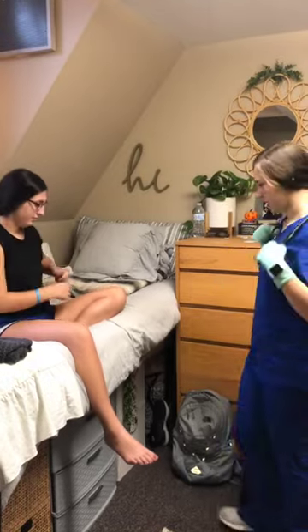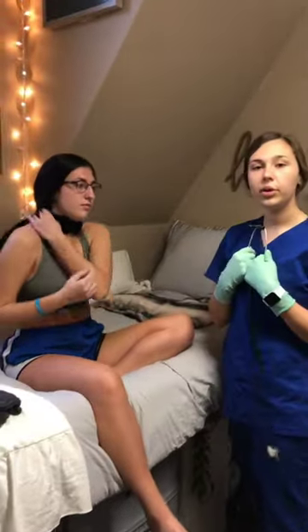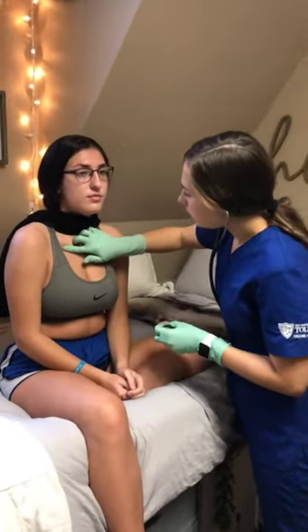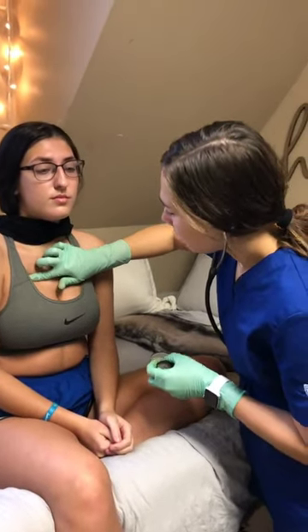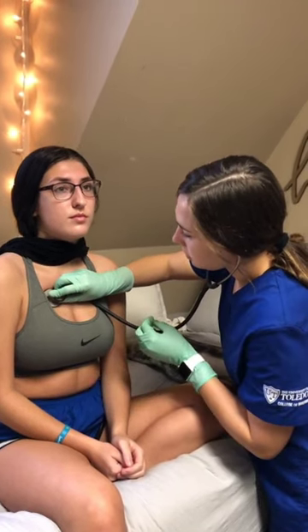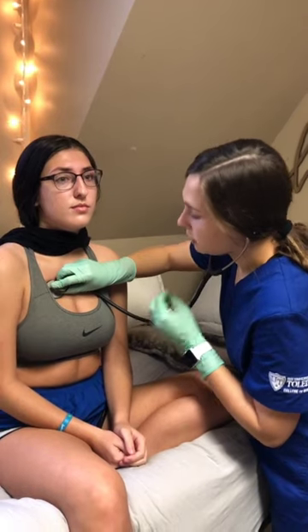I'm going to begin auscultating different positions on the heart. I'm first going to start with the aortic, which is the second right intercostal space. S1 and S2 was heard.